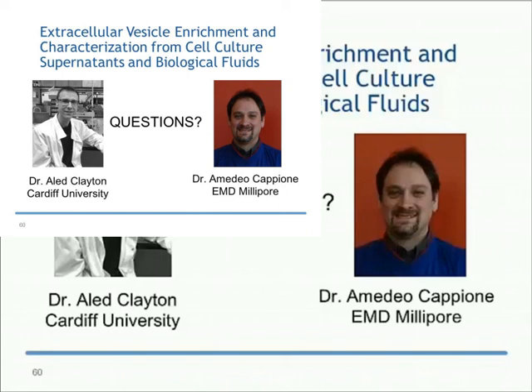So please, if you're buying stuff from companies which claim to be exosome-depleted FBS, do engage with them, get a clear answer from them how they're doing the depletion, and understand how that process may impact your downstream analysis of your work. I think it's really important to know that.